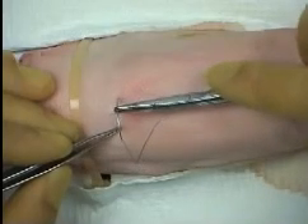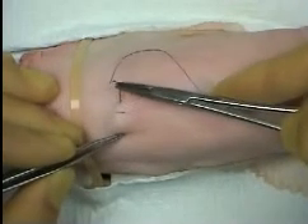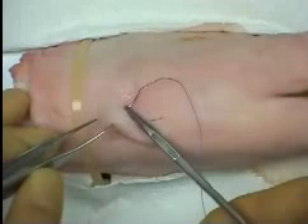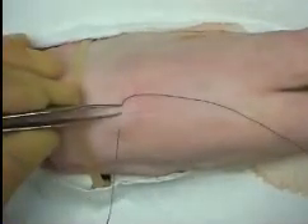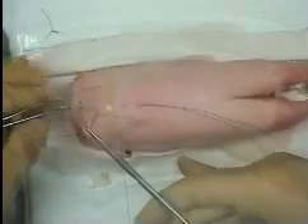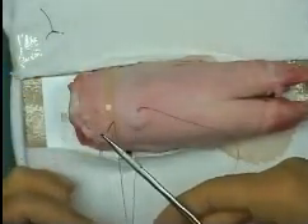To make a bite through the skin, start with the needle point perpendicular to the surface. As the needle is advanced, turn your wrist so that the needle follows a curved path and will emerge at an equal distance from the opposite edge of the wound. Use your assisting forceps to apply gentle counter pressure and then grasp the needle as it emerges from the tissues.